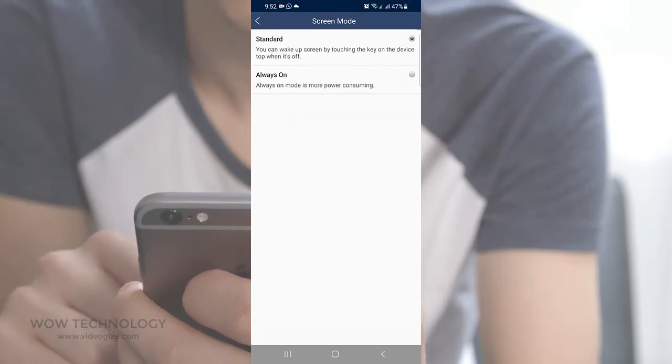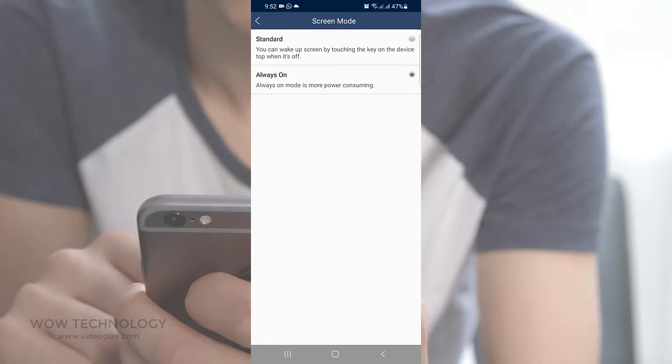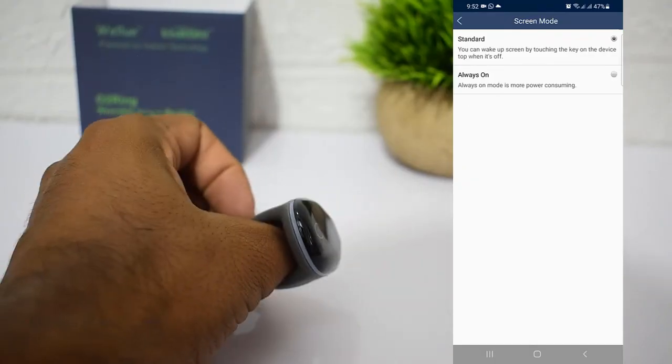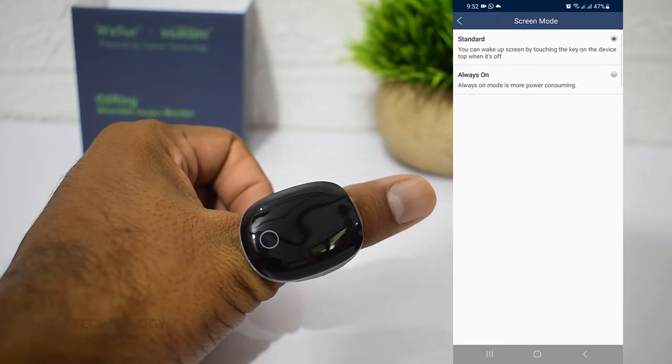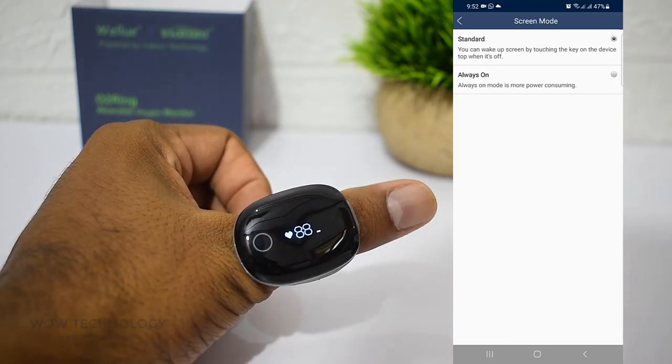You can adjust your ring screen mode as Standard or Always On. Remember, Always On mode is more power consuming, so I recommend Standard mode. In this mode your ring will continuously track your data, but the display will turn off after a while to save battery. When you want to see the readout, just tap the circle and it will wake up.